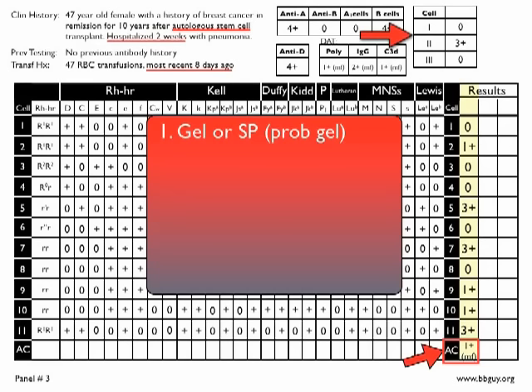Classically seen in settings where a patient has been recently transfused and an antibody is reacting against the transfused cells. So the autocontrol is positive. That will lead us down a couple pathways that we'll talk about in a moment. When we look at the actual reactions, again, we have positives and negatives. This is outside of the autocontrol. We have positives and negatives. We have 3+, we have 1+, and we've got some negatives, as I said before.